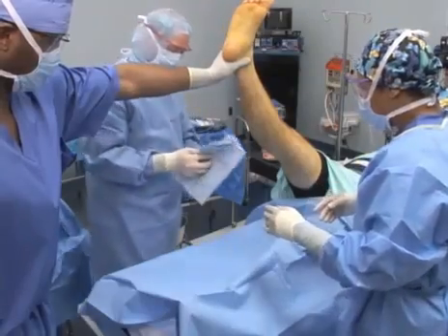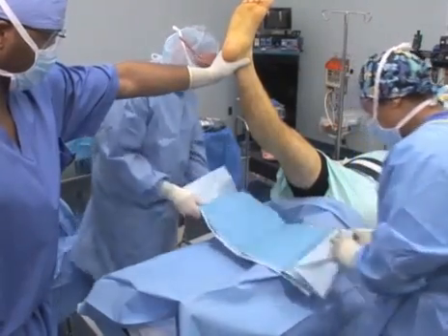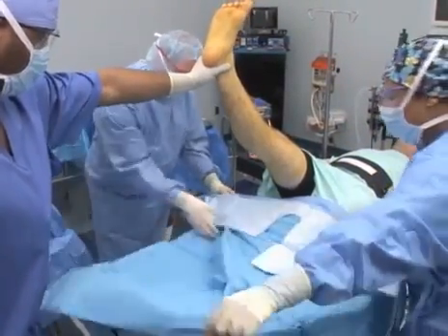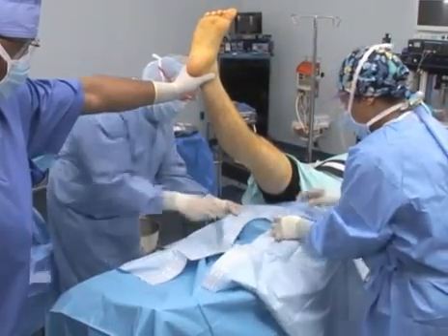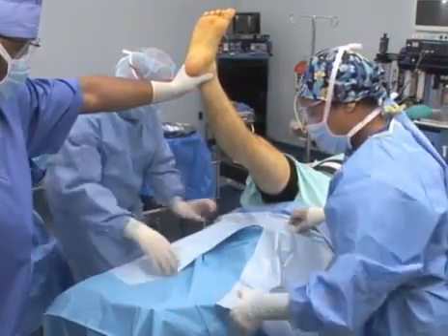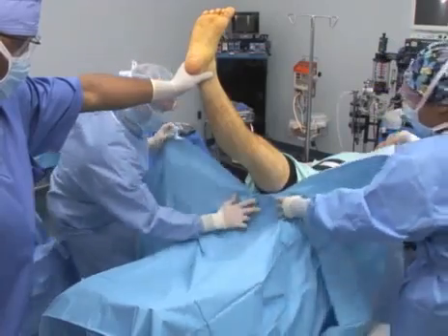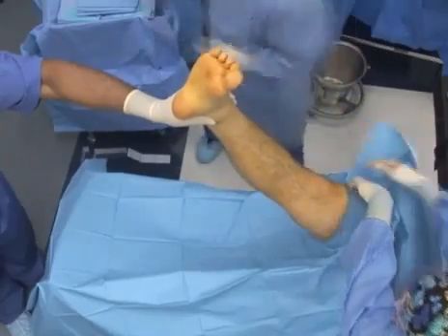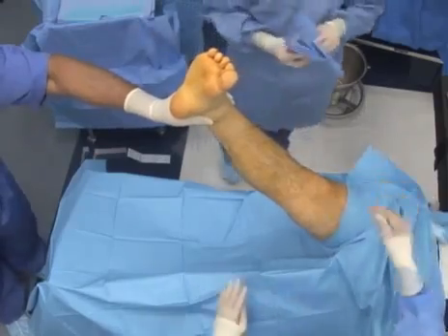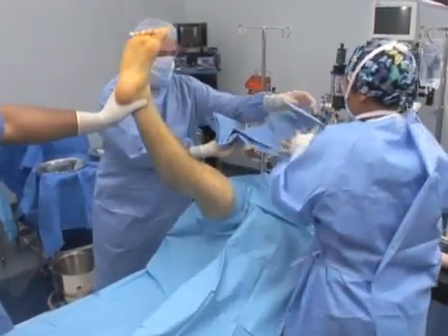Let's go to office. You drape number one? Yep, go ahead. A split drape is secured around the proximal, upper part of the limb. Drape number two? Up top. Thank you.